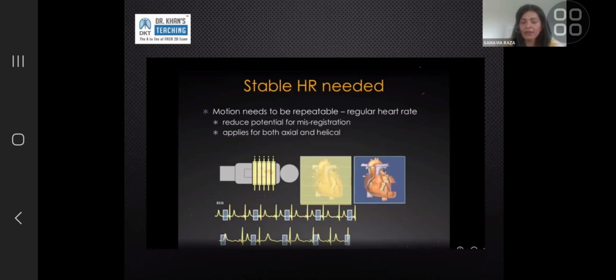Scanners are smart. They look at the ECG afterwards. They try to get rid of the images that are not suitable, or the images that were acquired when the ECG was abnormal or not compatible with what it thought it was going to be. Because every image is not acquired by just one rotation, it's acquired by multiple rotations, multiple slices contribute to every slice, if that makes sense.